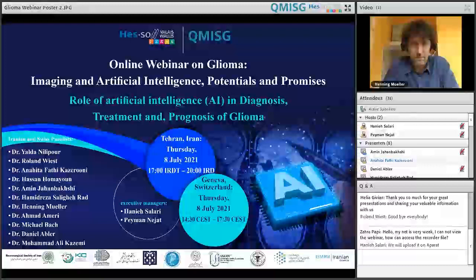One is a region with significantly restricted diffusion on day 2-3 after surgery. This restricted region is routinely an ischemic focus that is usually seen after surgery, and it is not tumoral tissue. If we recognize it segment by segment, we can map it, and AI and radiomics can also help us in this area.